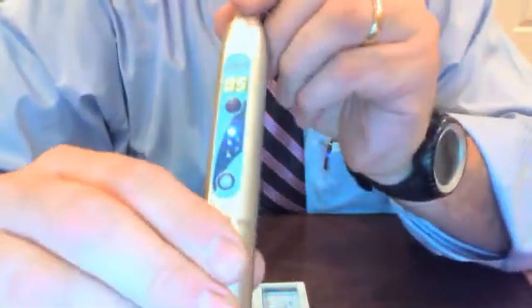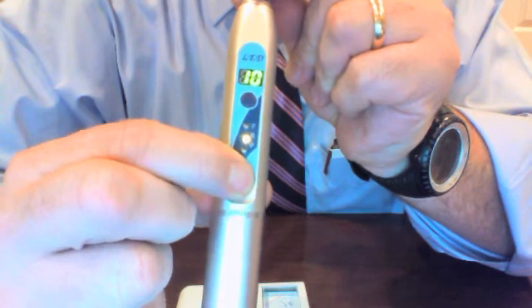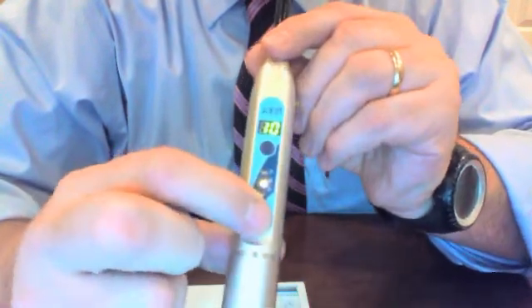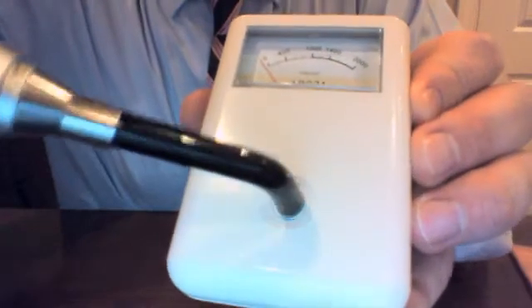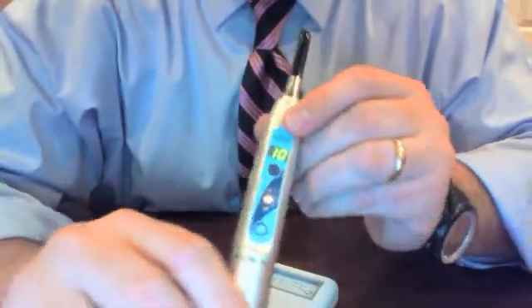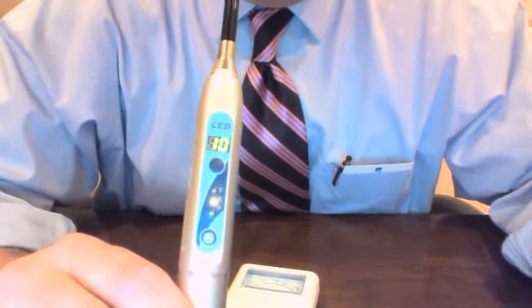Now I'm going to toggle down to ramp mode to illustrate how it works. I hold down the bottom program button — it's approximately three seconds to toggle between different programs. The ramp mode is available in 10 seconds, which it's set on now; hitting the bottom button again moves it to 20 seconds. For this demonstration I'll go back to 10 seconds. Using the radiometer, you can see it ramping up all the way to maximum power, it beeped at five seconds, and now it's off. The ramp mode is very good for larger composites where you want a slow cure at the top and get all the way to the bottom for an even cure throughout the material.